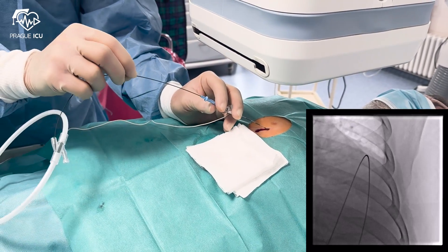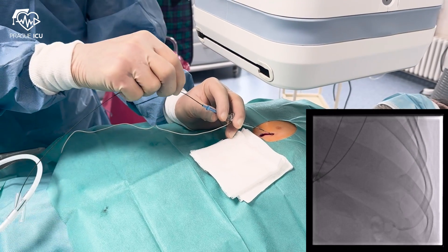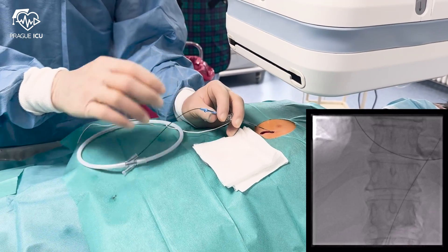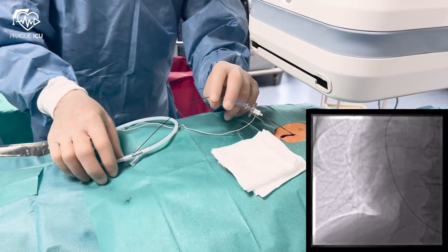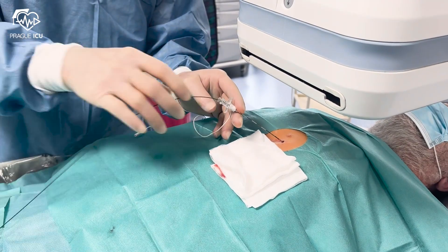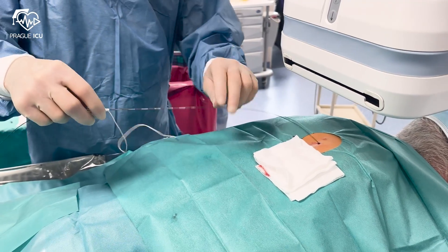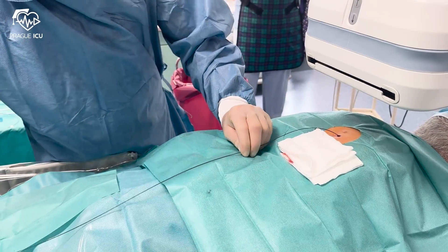Once a good position of the needle is confirmed, insert a soft J-tip guide wire into the pericardial space. On fluoroscopy, the wire should be wrapped around the heart and not present in a specific vessel structure such as the pulmonary artery. In addition, check the ECG while advancing the wire — if ventricular extrasystoles occur, check the wire's position again. Now withdraw the needle.